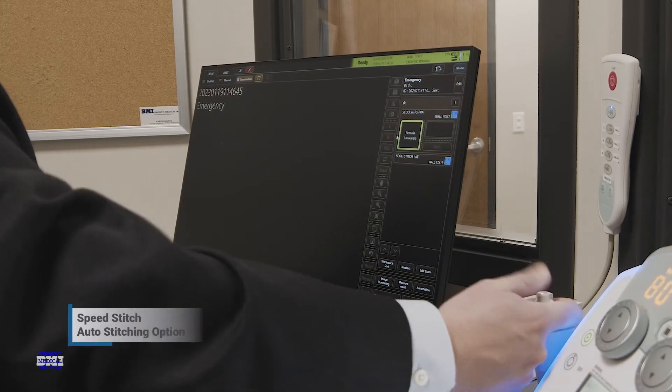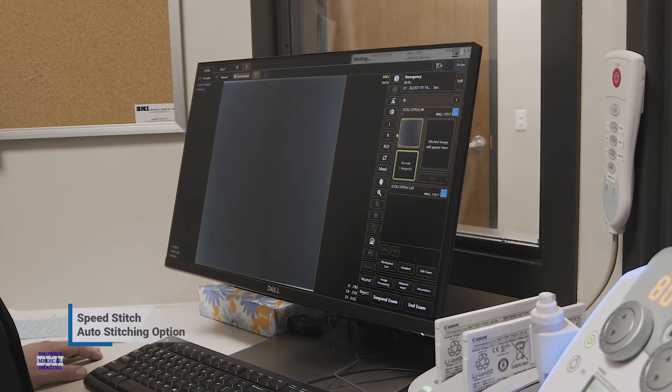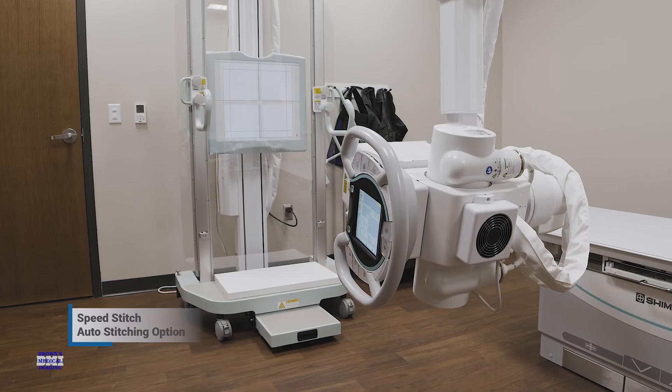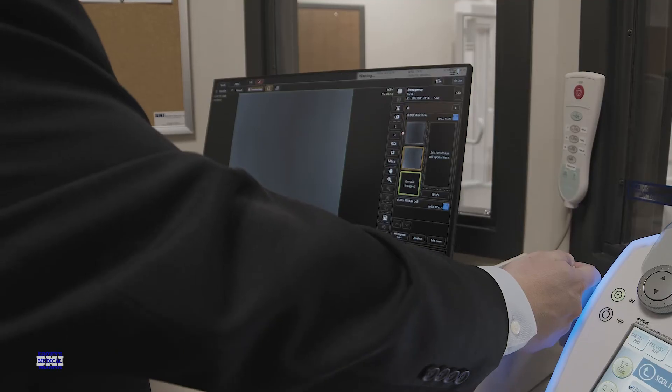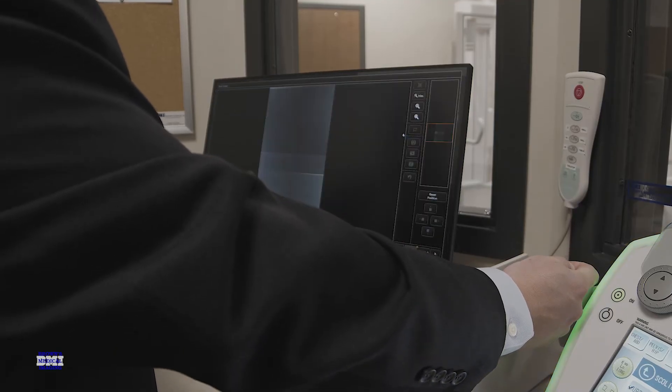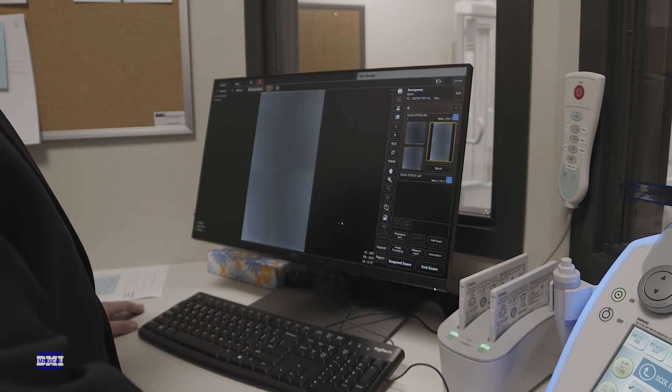The auto-stitching option, Speed Stitch, takes multiple x-ray images and stitches them together to create a single image with a much wider range along the body axis. This saves time and ensures that you get the most accurate and detailed view of the patient possible, making it easier to make your diagnosis more quickly.